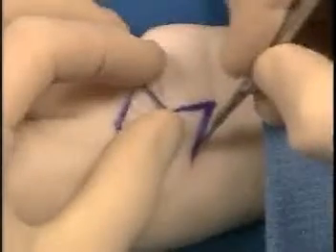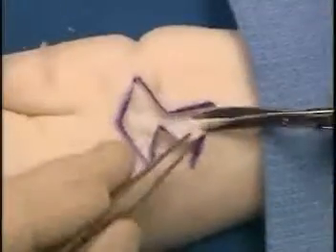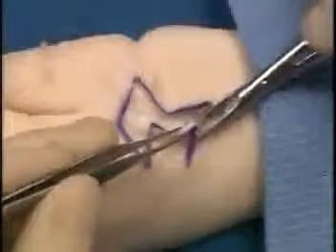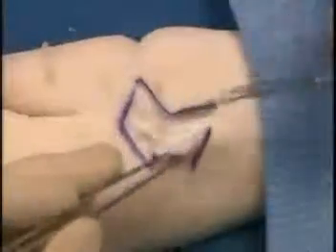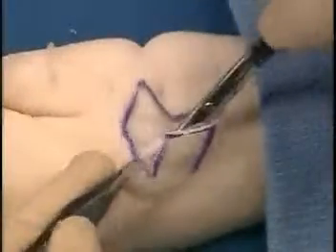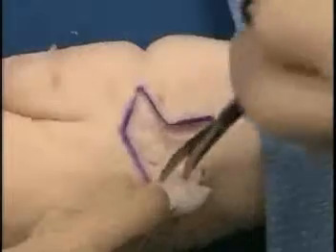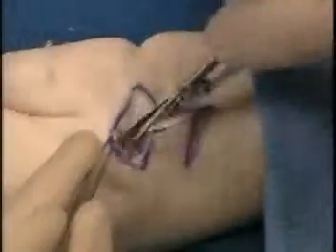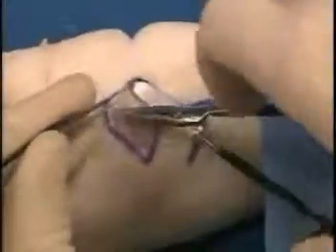And now the incision is made along the superior limb, and now at an angle of approximately 60 degrees, the second incision is made, mobilizing the flap now with a pair of dissection scissors with the tips up. Again, you may use a 15 blade or dissection scissors. Be sure to widely undermine this tissue, and again, the tissue may be undermined using scissors or a 15 blade.